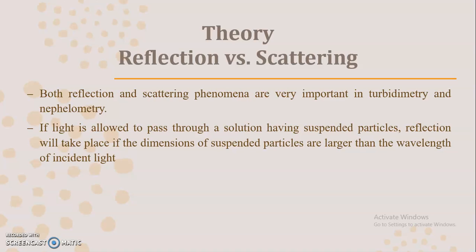Which phenomenon will occur largely depends upon the size of the particles that are present. If the particles have larger dimensions as compared to the wavelength of the incident light, then reflection will occur.